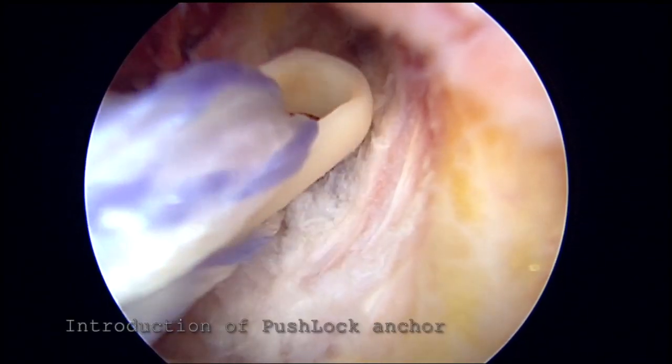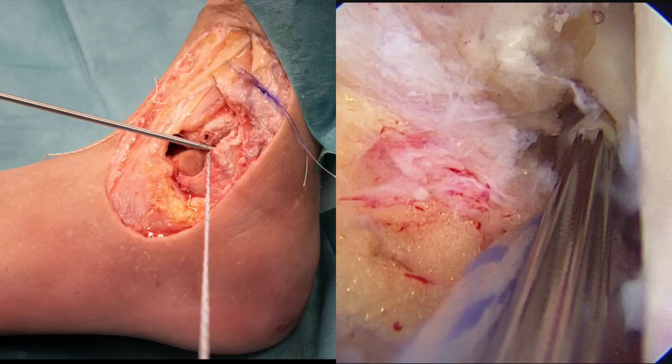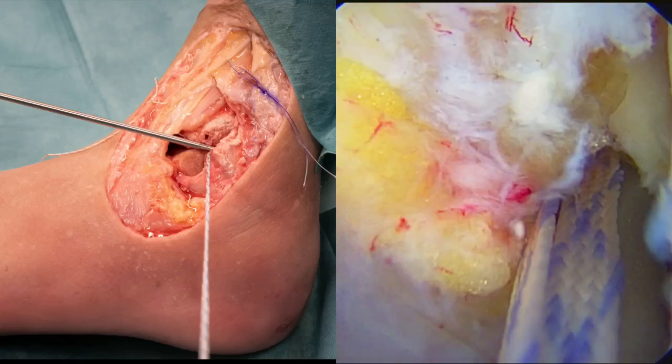The anchor is advanced into the tunnel and tapped until the laser line is flush to the bone. The suture tape ends are cut and we can test the stability of our ligament repair.